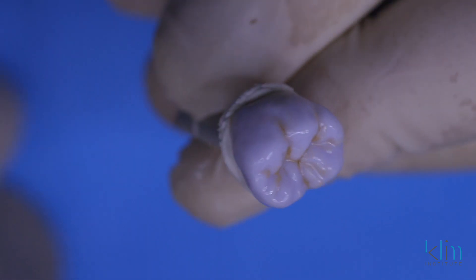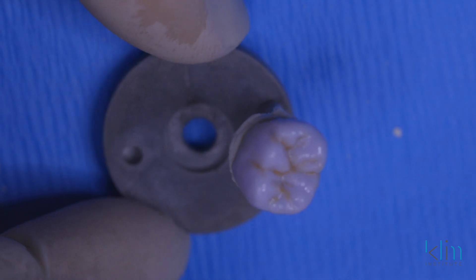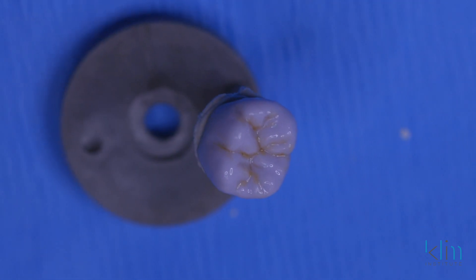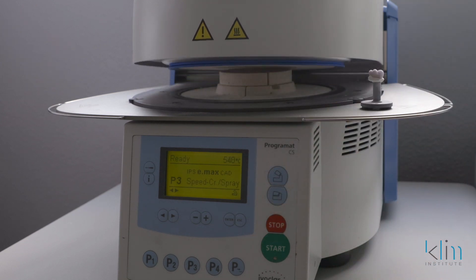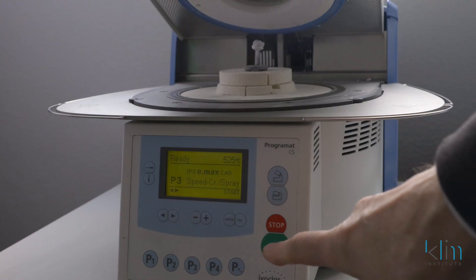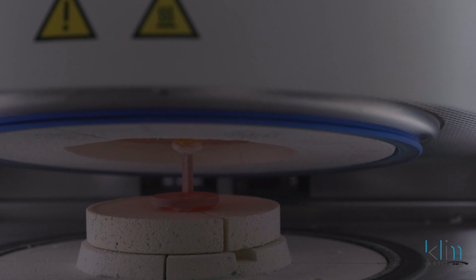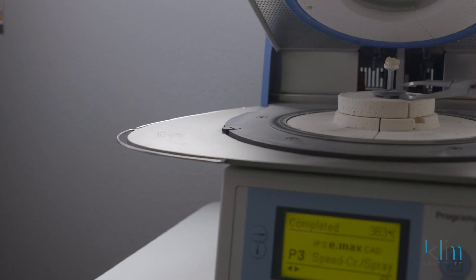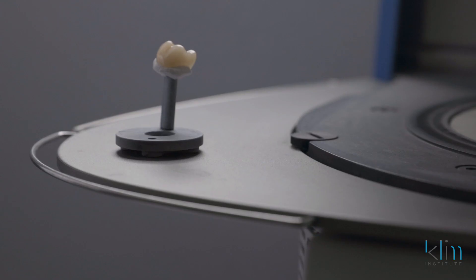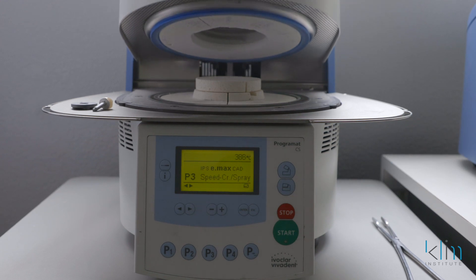And there we have it — we're ready to take this to the furnace. We're going to place this on the small firing pin for the fast cycle; this is P3. When you open the hood, be ready to place that restoration in the firing zone in the middle as quick as you can and hit start — that will keep the temperature from cooling down too much to optimize your firing time. Lay the restoration on the cooling tray to help cool down that ceramic in a more effective way. You want to wait a few minutes before you retrieve.